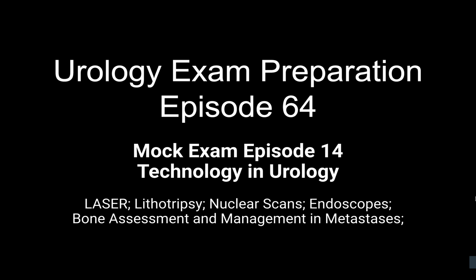So if you are able to use your fiber optic ureteroscopes for say 18 to 20 patients, that's good. It's important for you to have this data. When you're doing a tabletop review with one of your managers, you should be able to say this scope worked for 20, which is the world average, so we have done a good job. Let us buy some more flexible ureteroendoscopes and maintain them.